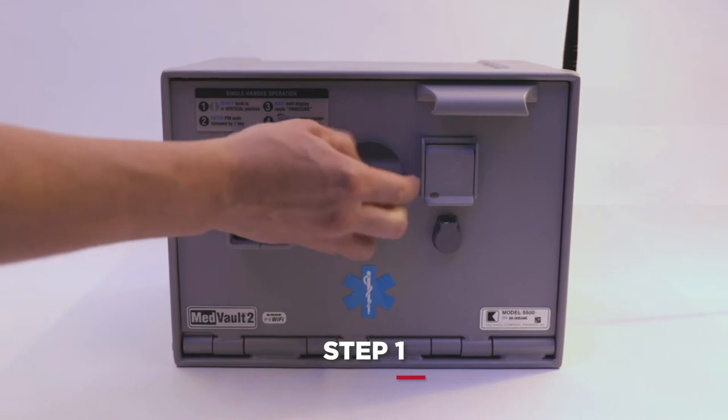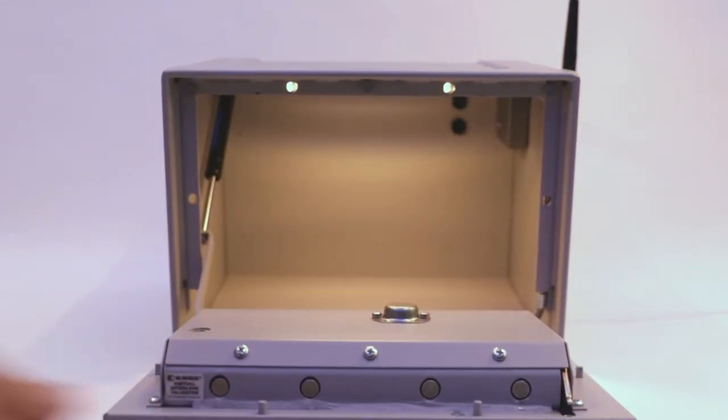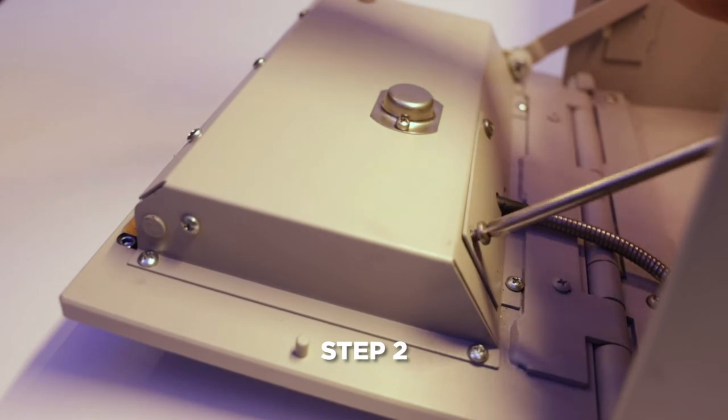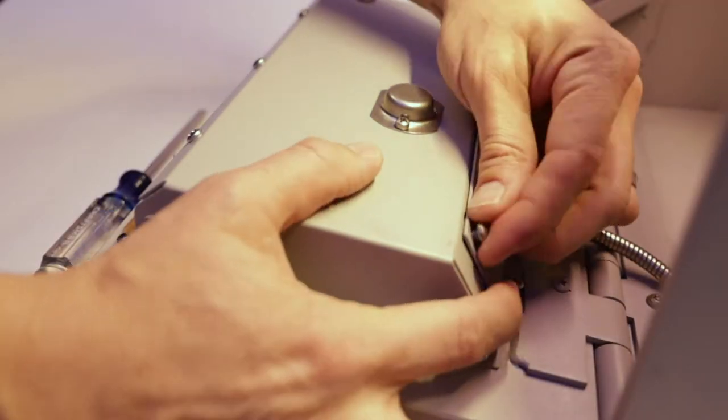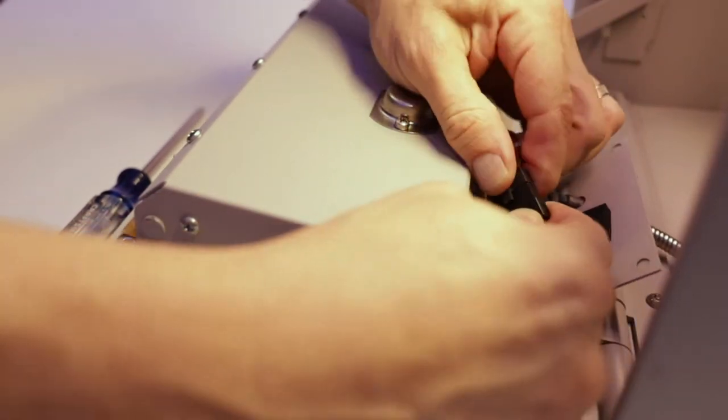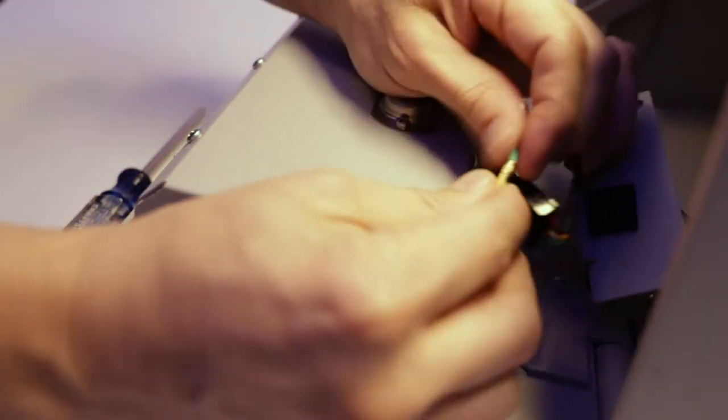The first step is to ensure the Medvault door is open. Remove the screws from the service panel. Remove the two screws from the back plate, then disconnect the power first and then the coax connection for the antenna.